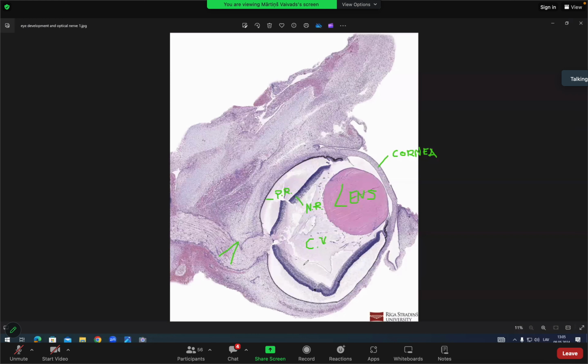So all these structures repeat again and again. You can even see small eyelid fragments, but what stands out here with the green color, you see fragments here. Now I'll put number 2. All of these are hyaline cartilage.